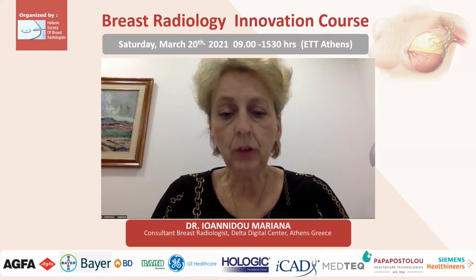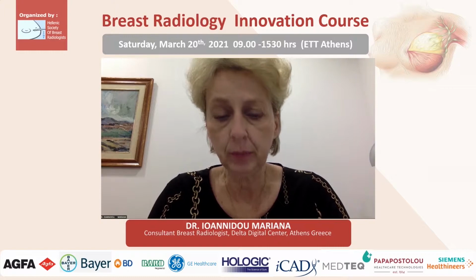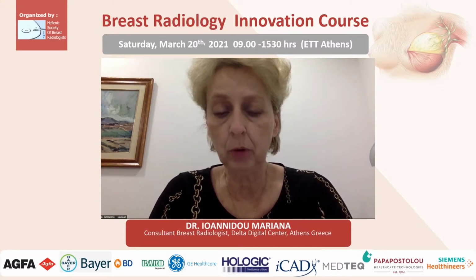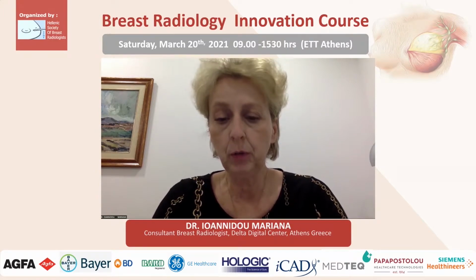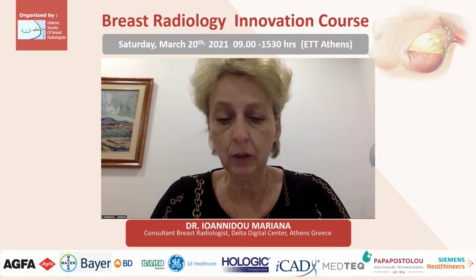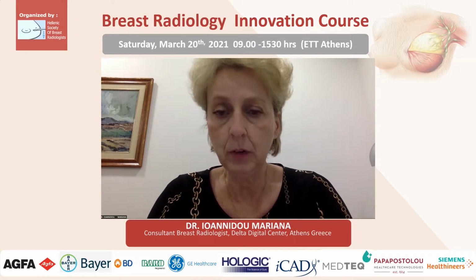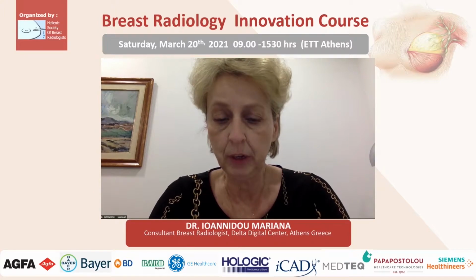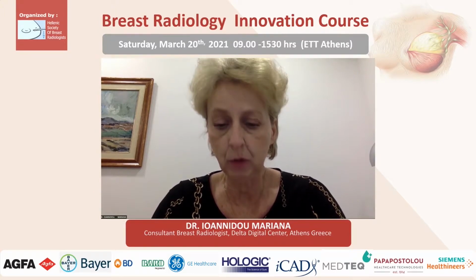So our second table starts with two presentations for contrast-enhanced mammography. CEM is an emerging modality that combines digital mammography with the administration of intravenous contrast material for the assessment of neoangiogenesis. Breast cancers can be identified on CEM by density and morphological characteristics on low-energy images, as well as by iodine uptake, intensity, and pattern of absorption on the recombined images.